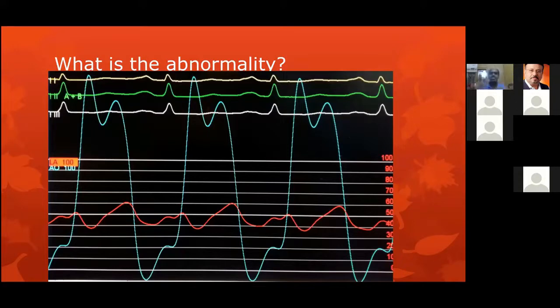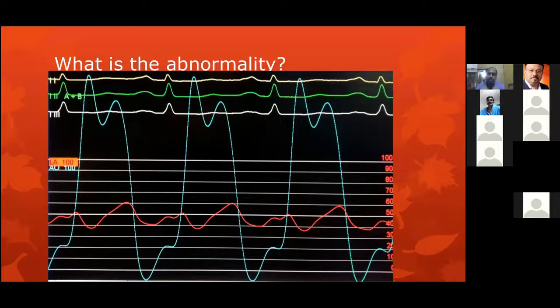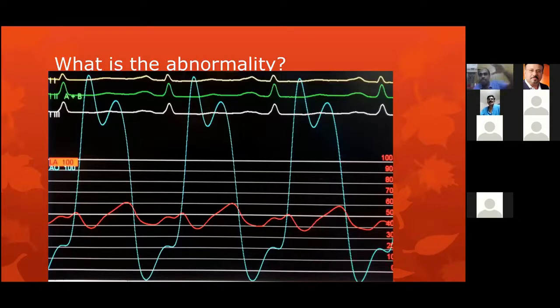The atria has contracted causing the tall A wave, and the X descent is happening due to atrial diastole. There is also ventricular systole, which is pulling the tricuspid and mitral annulus towards the ventricular apex, which stretches the atria. So the X is caused by a combination of atrial relaxation plus ventricular contraction, which is pulling the AV valve down.